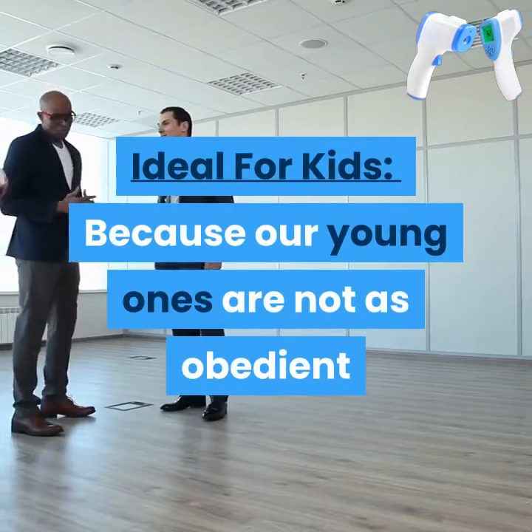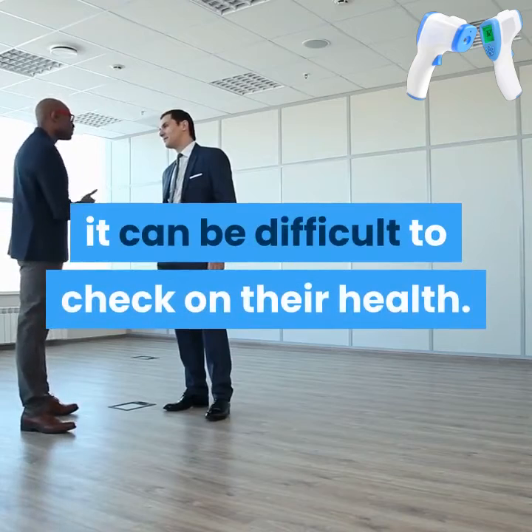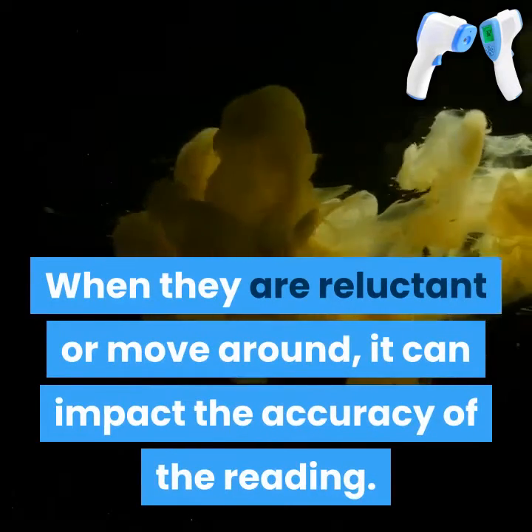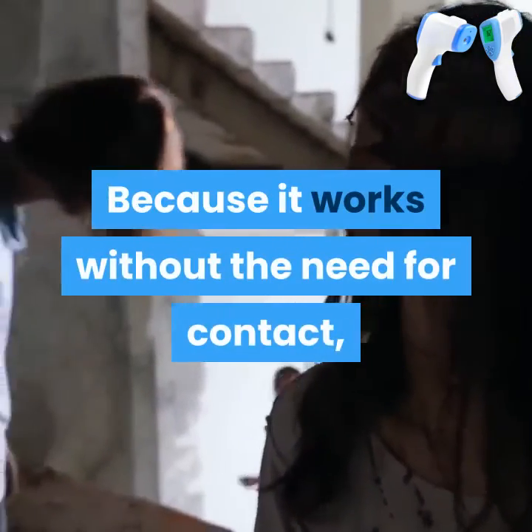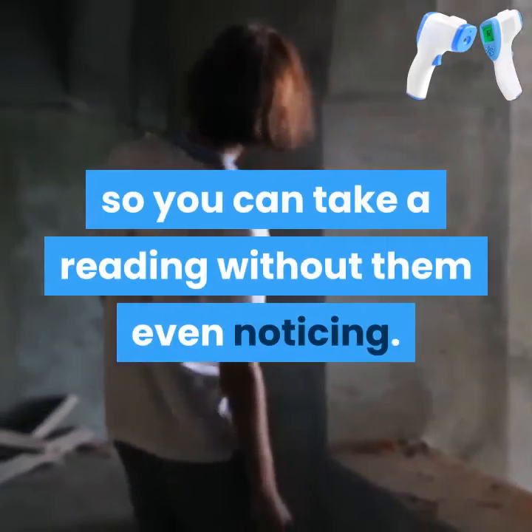Ideal for kids. Because our young ones are not as obedient when it comes to taking their temperature, it can be difficult to check on their health. When they are reluctant or move around, it can impact the accuracy of the reading. Because it works without the need for contact, you can hold Live Temp Pro at a comfortable distance so you can take a reading without them even noticing.